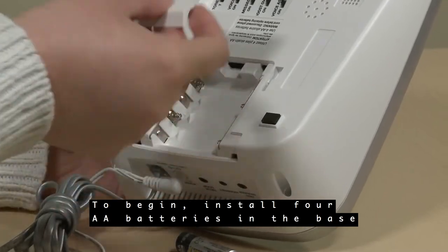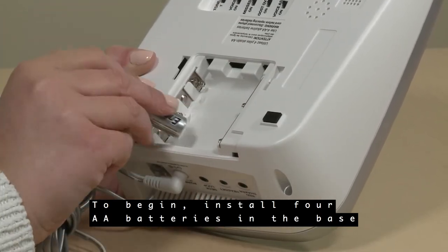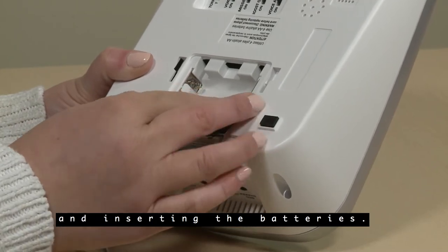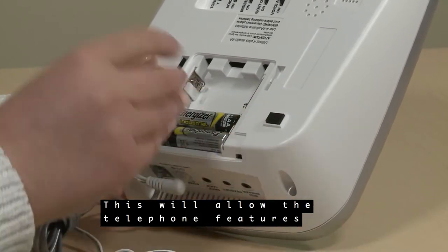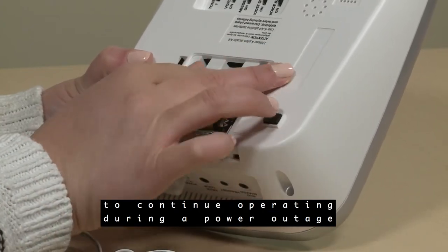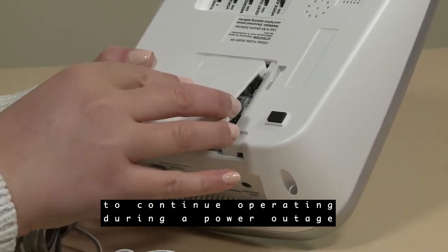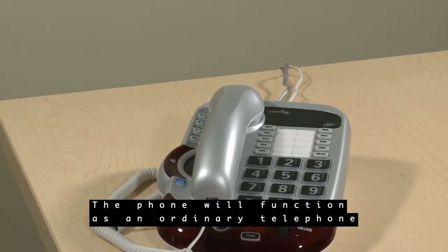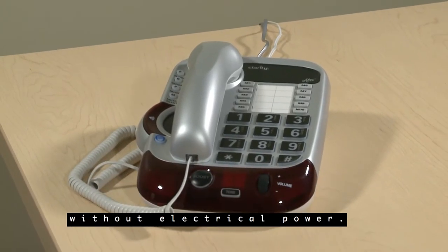To begin, install four AA batteries in the base by removing the battery cover and inserting the batteries. This will allow the telephone features like amplification and indicator lights to continue operating during a power outage for up to 48 hours. The phone will function as an ordinary telephone without electrical power.